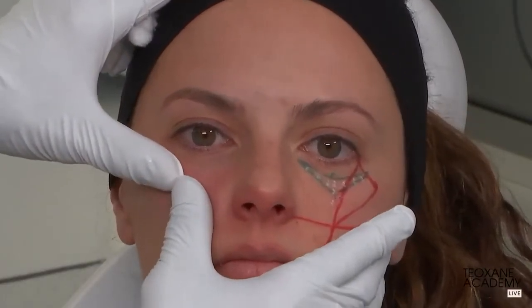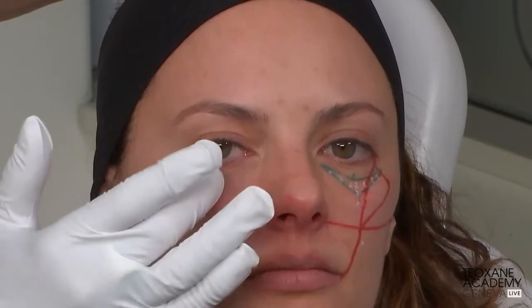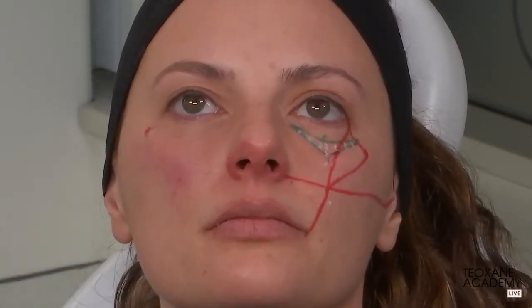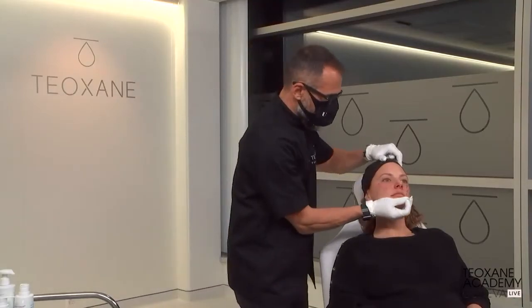And at this point, I look at the change that I achieved with just this half syringe on this side compared to this side. And you see that it is already looking much better. There is some more work to do laterally and all across. But now we are approaching a very delicate area, and I will use a dedicated product for that. So, you already know, Patrick, which product I'm talking about.